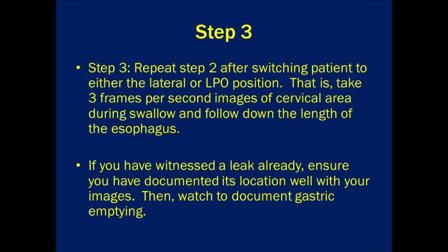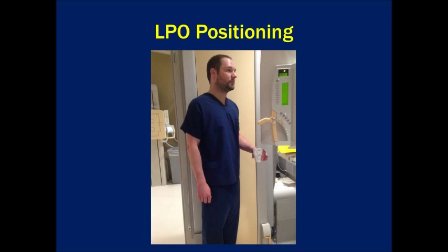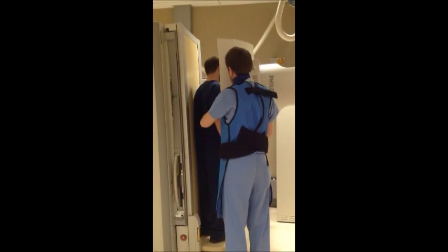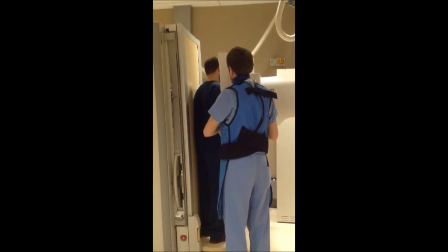In the next step, repeat step 2 after switching the patient to either the lateral or left posterior oblique position. If you have already witnessed a leak, make sure to document the location to compare on other views. Here is an example of the patient in the left posterior oblique position. Here you can see the resident following the contrast bolus with the fluoroscopy image intensifier with the patient in the left posterior oblique position.